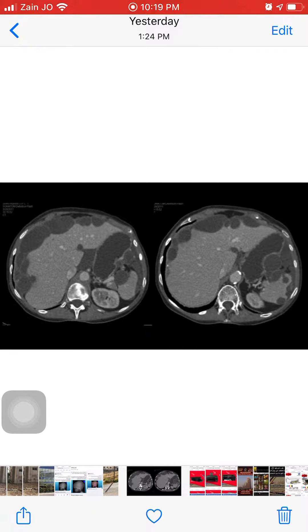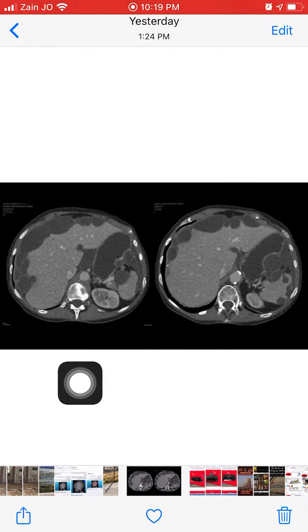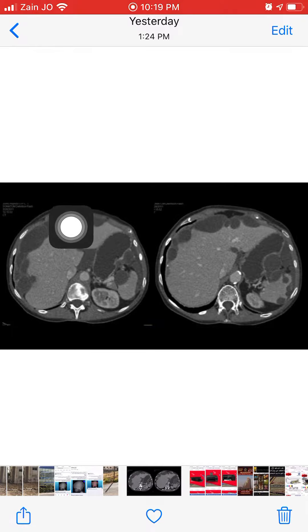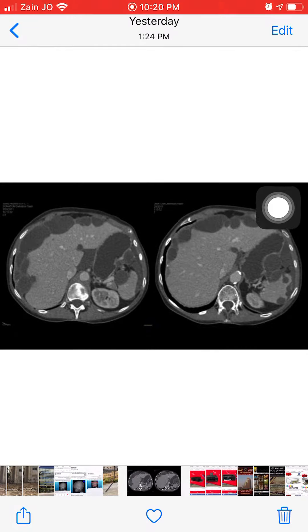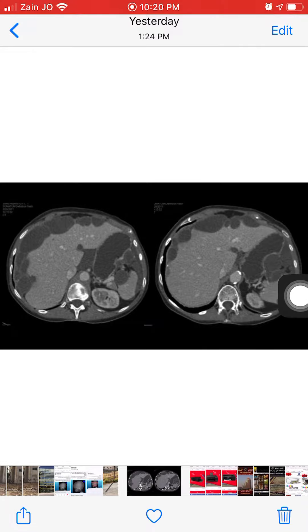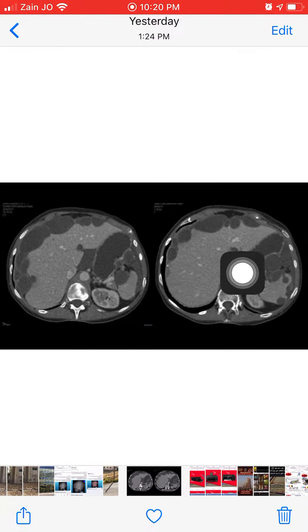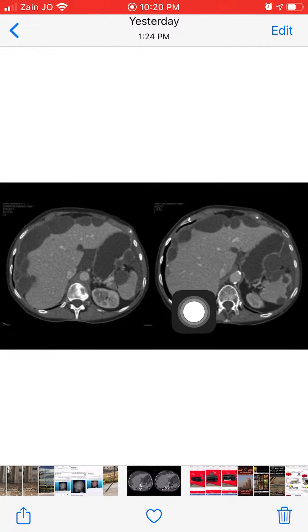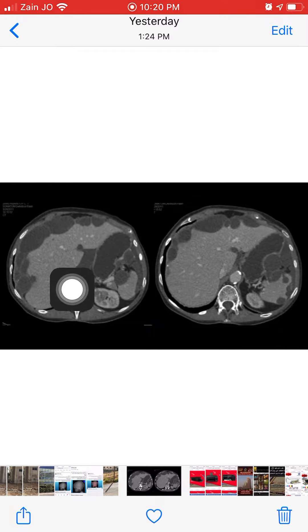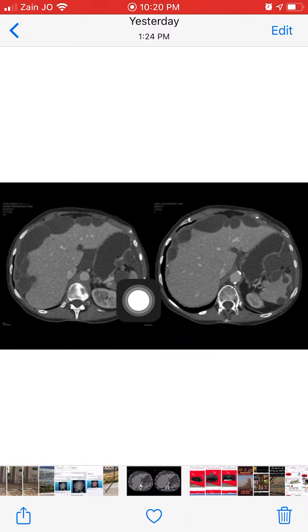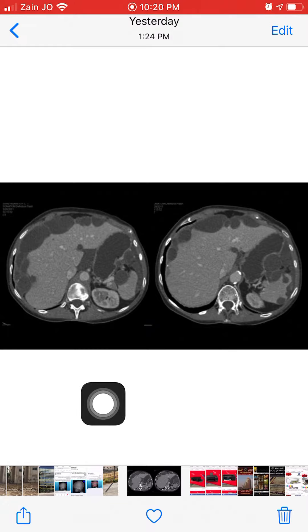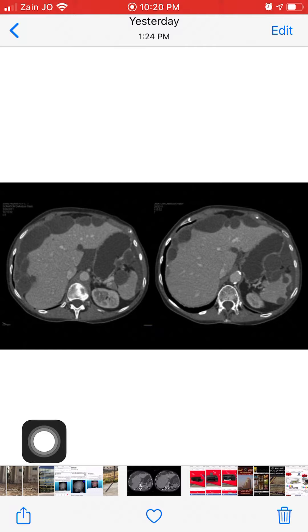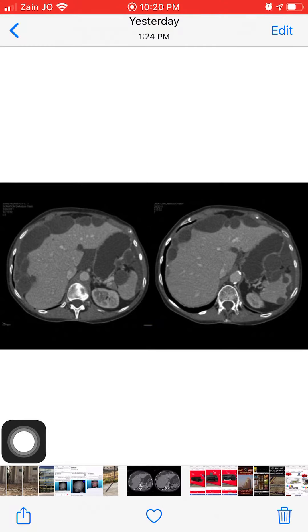As we see here in the axial cut CT scan after contrast, we see a patient with ascites. The ascites is causing scalloping of the liver and also scalloping around the spleen, as well as some indentation of the stomach's greater curvature. This scalloping and accumulation of ascites is due to pseudomyxoma peritonei, and this is a classic case of the condition.